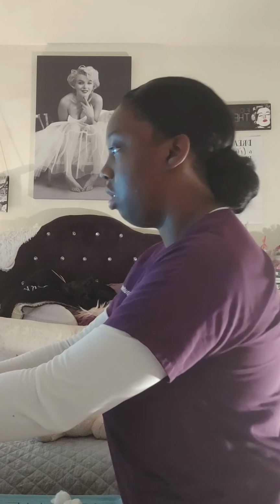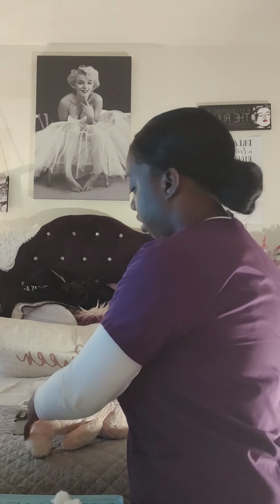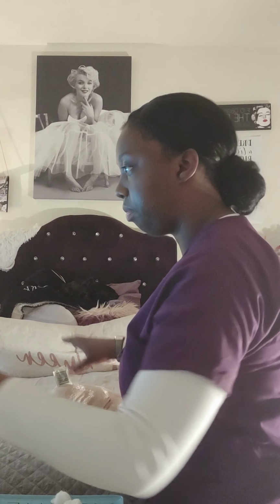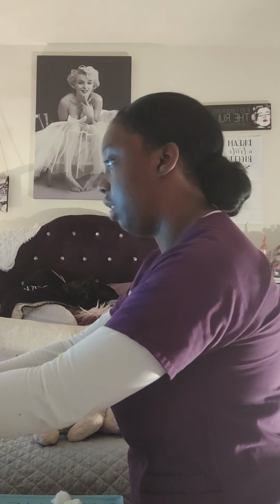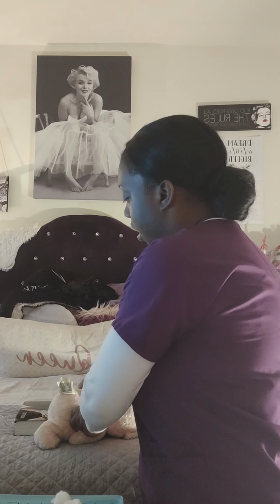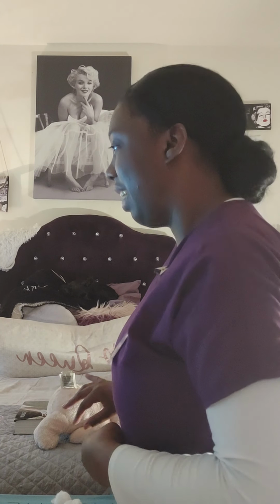Alrighty. So you can have the patient laying sideways when you give this medication. I'm going to put her about like that so you guys can see it. Now that she's laying sideways, you can go ahead and flex the hip to make it better for you to see it.